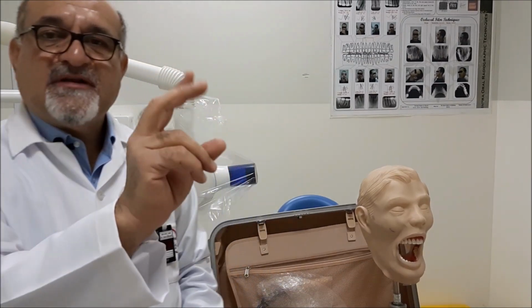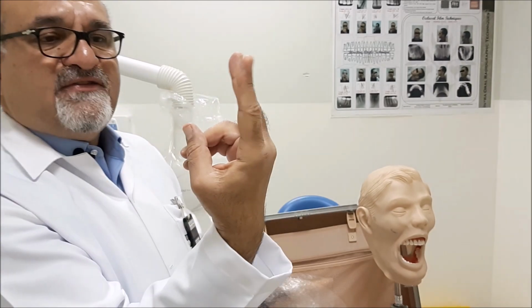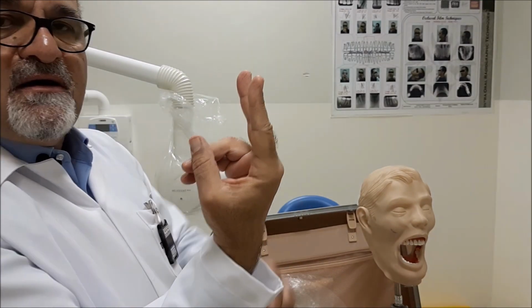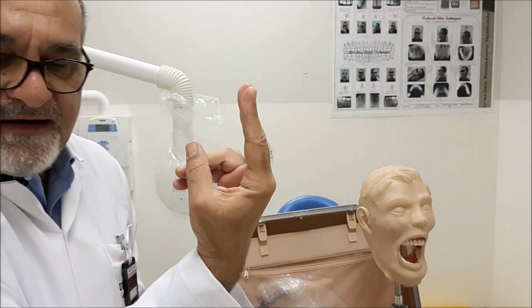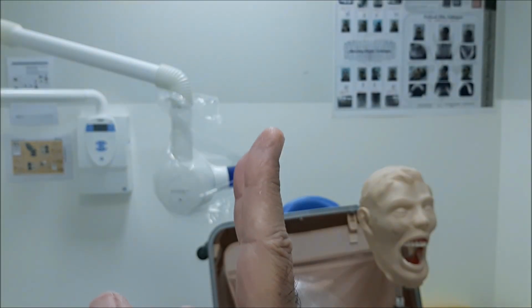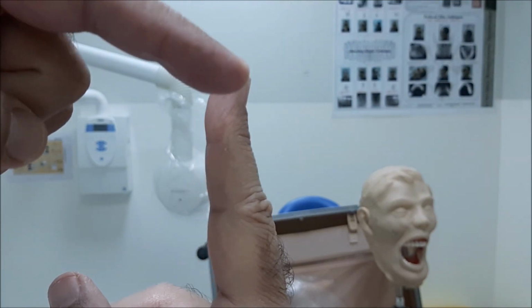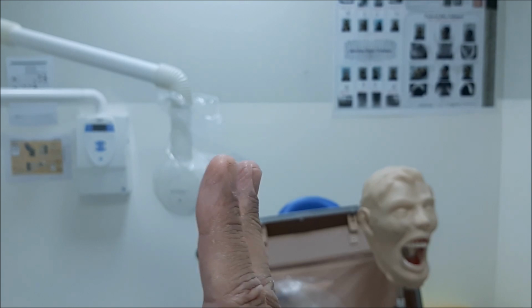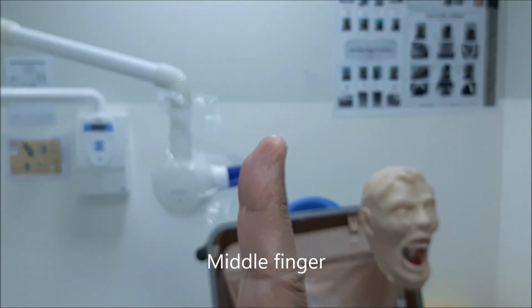I'll just demonstrate it in front of the camera. If this is the buccal canal, now it is covering the palatal canal, which is the middle finger.